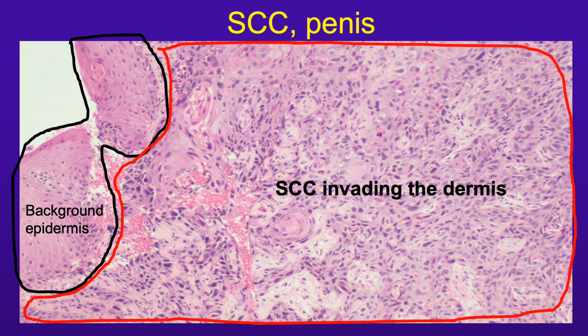In some areas of this SCC, the tumor cells do appear a little bit more pale, but the most pale areas are actually collagenous or myxoid edematous stroma in between tumor aggregates. So this is stroma here. Here's tumor. Now this is stroma here. Here's a keratin pearl. Not the best formed one, but happens to be right there.